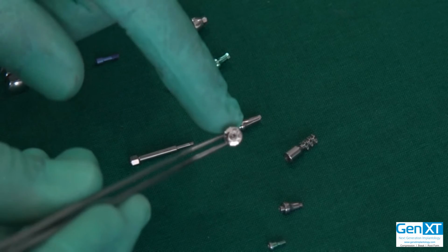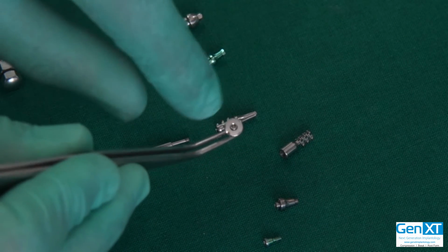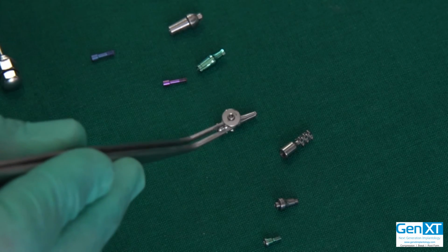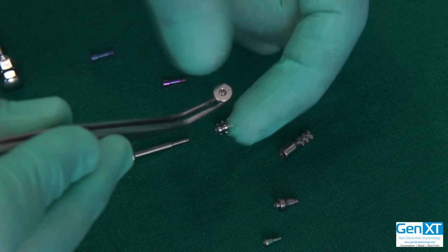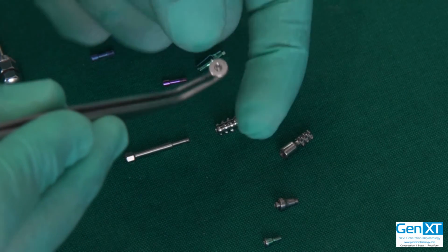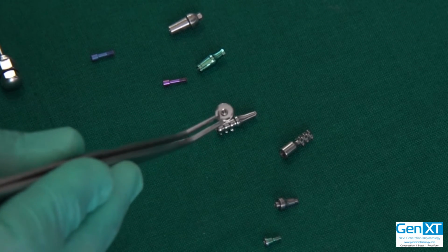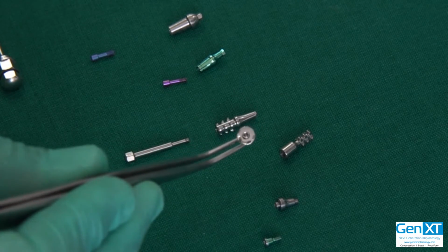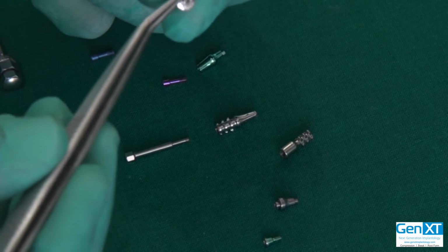You can use it, for example, in the molar region. And if you want, you could also trim it from the sides. For example, I could trim this from the side and use it as a premolar, so that it is long buccolingually and narrower mesodistally. I could use it in a central incisor similarly to create that big wide emergence. So you can customize it, put it in the right position, and then using the screw, you can screw it in properly.